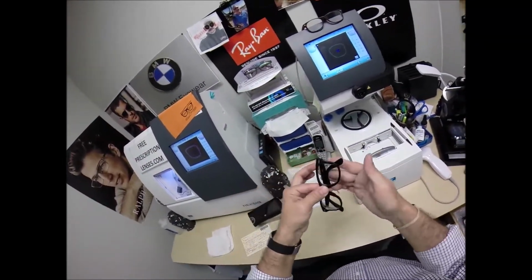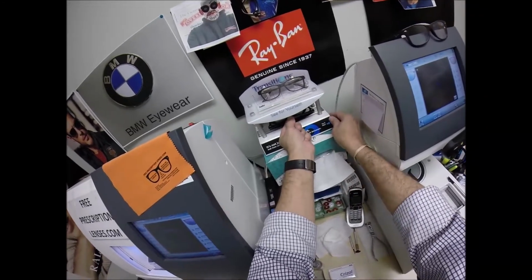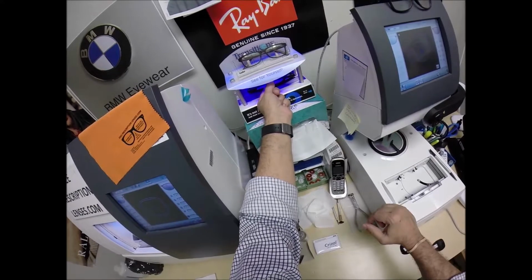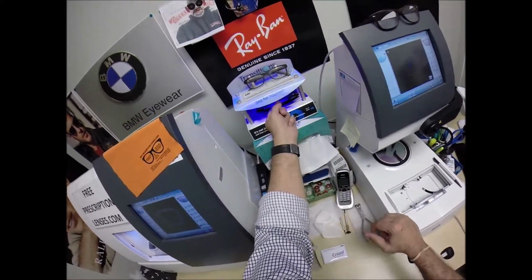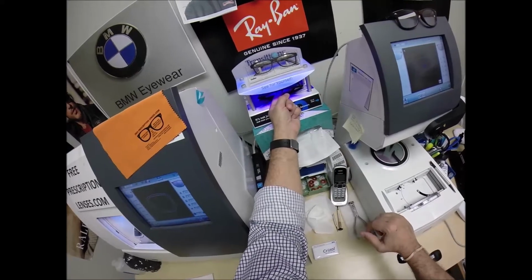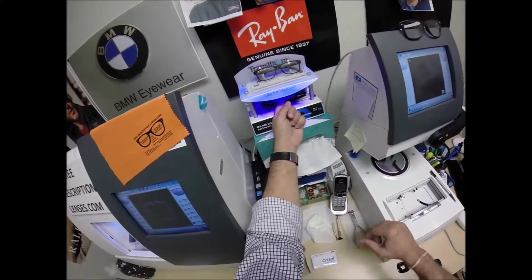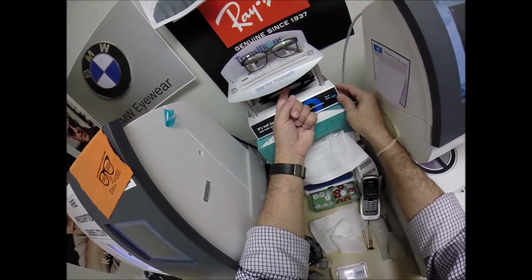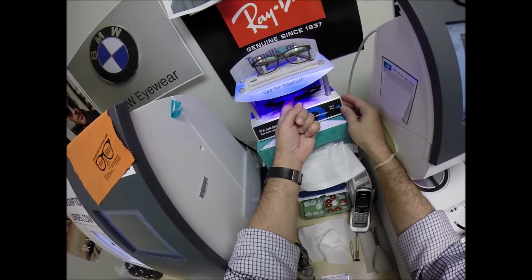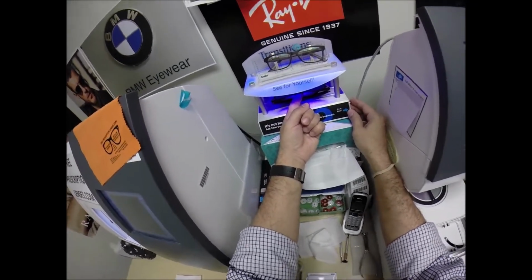So let me go ahead and put your frame into my transitions box to expose them to a strong burst of ultraviolet light. Now as you can see, it takes about 30 to 45 seconds for transition lenses to darken. It takes a little bit longer when you come back inside, 45 seconds to a minute 15 to return back to virtually clear. Now Bumbino and everyone else listening, this is important. All transition lenses will get dark on day one and continue to darken every day for the first 2 weeks they're exposed to the sun. After that, they will work for years at maximum performance.